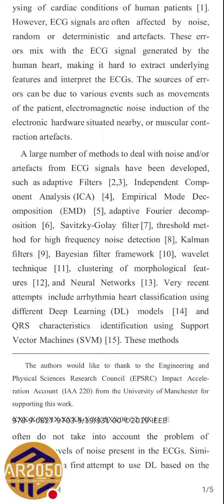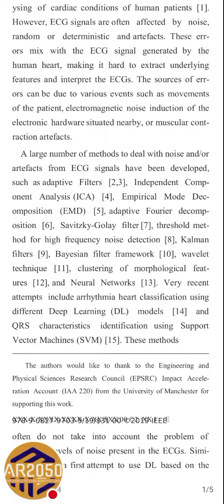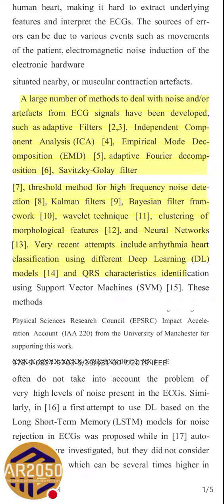A large number of methods to deal with noise and artifacts from ECG have been developed. Now we are going to learn what kind of techniques were used before in the previous literature, such as adaptive filters. These are the most common ones. Sometimes when we can't use complex hardware to remove noise, we need to stick with the old op amps and some cheap filters.